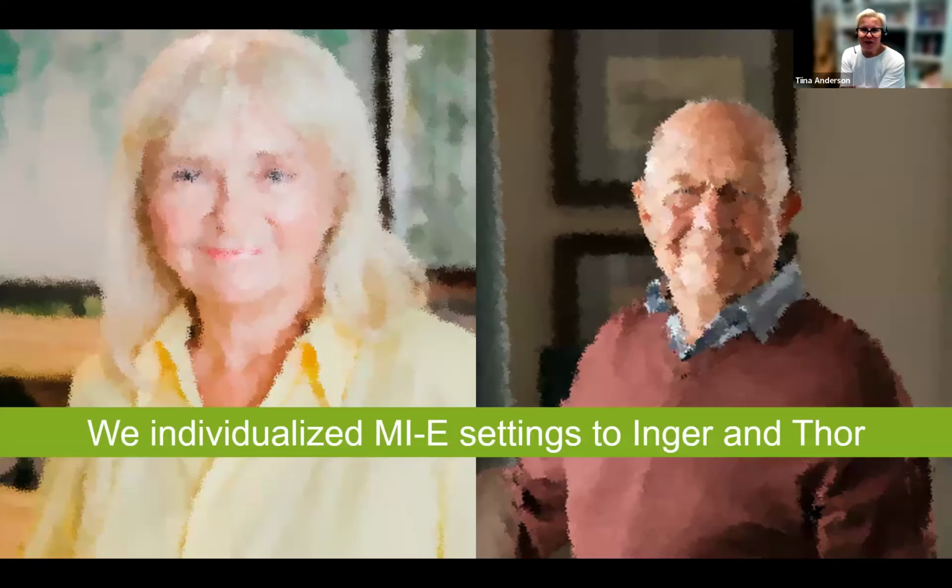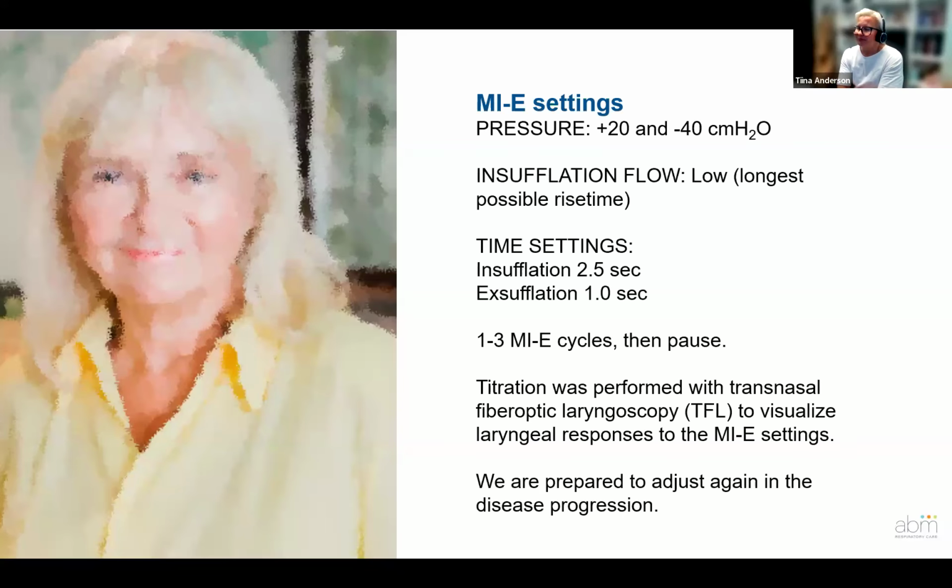And we individualize the treatment also for Inger and Thor. So Inger, he wasn't familiar with MIE at all. And we understood very rapidly that the insufflation was the problem with the visualization of the upper airways.